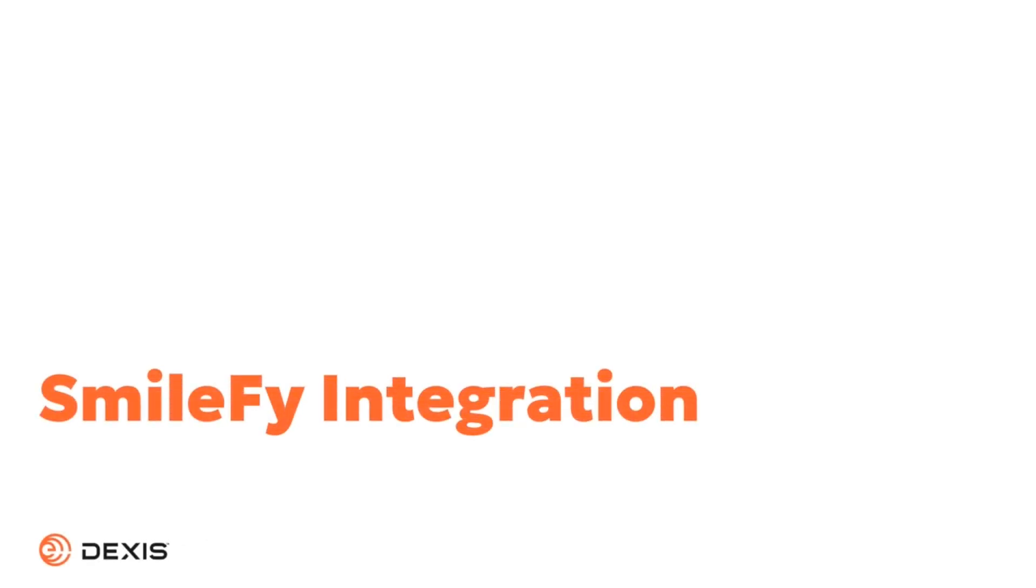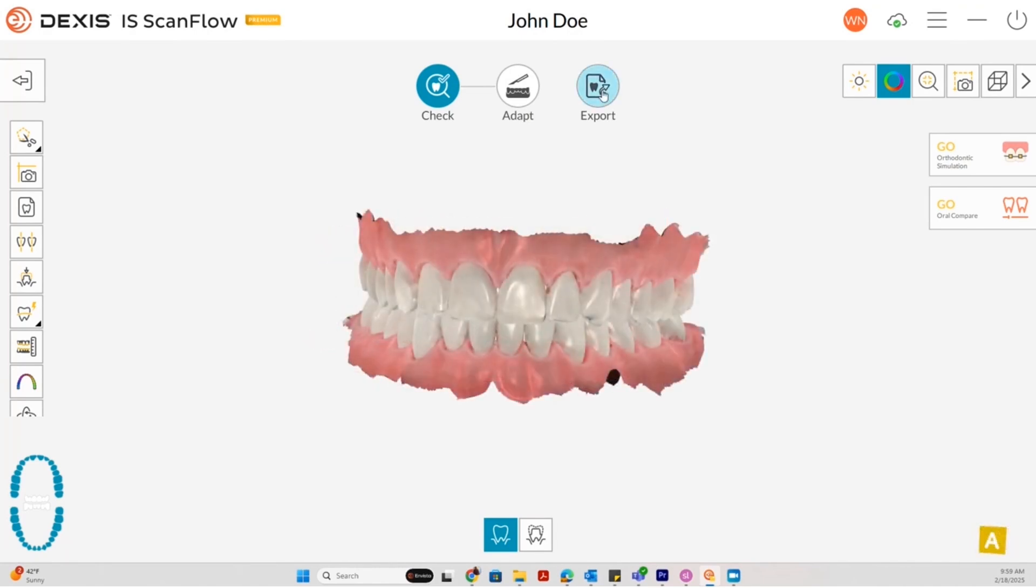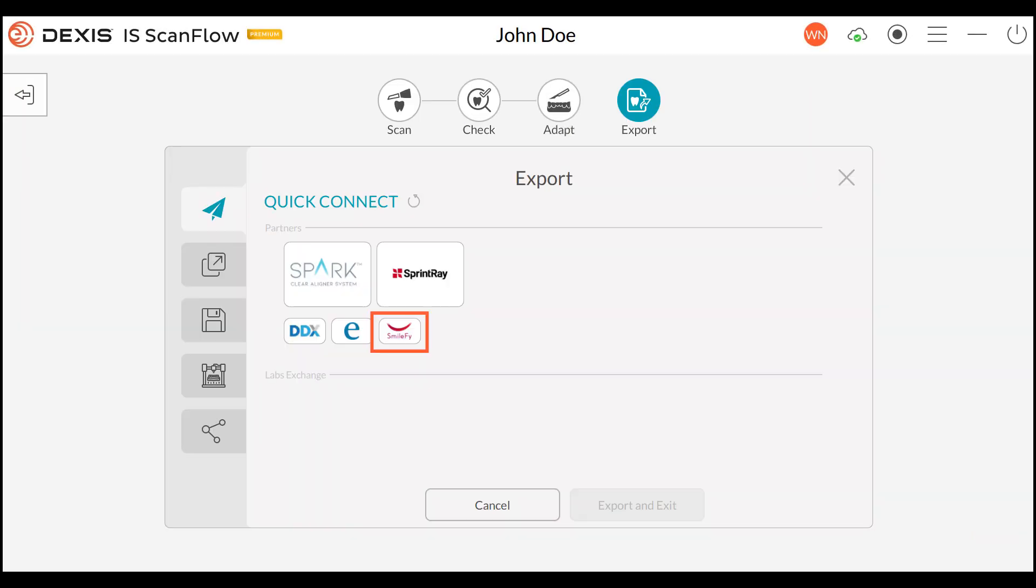SmileFi Integration. We are excited to announce a new collaboration with SmileFi which empowers dental professionals to create digital simulations of smile designs and facial results chair-side.